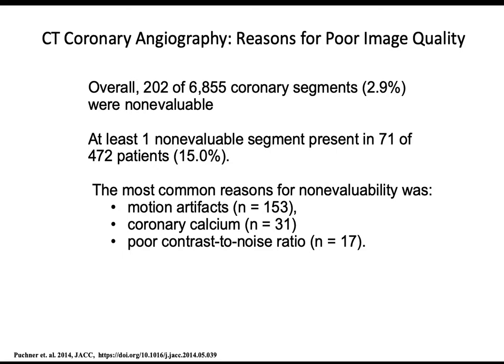So if you think about it, if you go to the CT scanner, you lay on the table, someone's going to put an IV in your arm, and the first question is, what size IV were they able to put in? If it's a very small diameter catheter, you may not be able to push at a rate that's fast enough to really mix with your blood and cause a big signal increase. The other thing is they're going to give a bolus that injects for 10 seconds and then it stops. Now that iodine is traveling up your arm, into your veins, mixing, going into your lungs, and then you take a picture when it's in your coronary vessels.